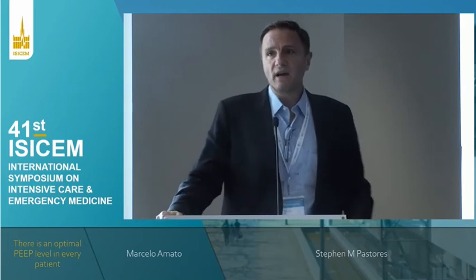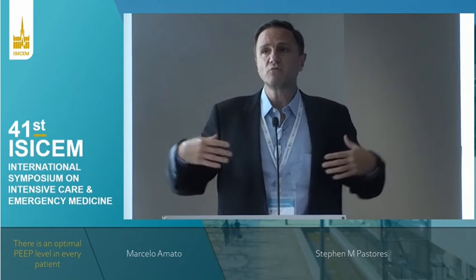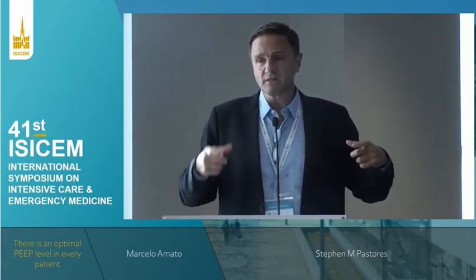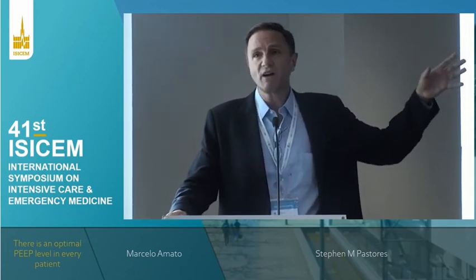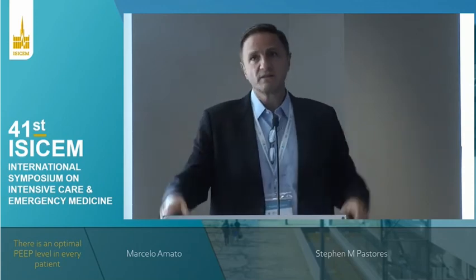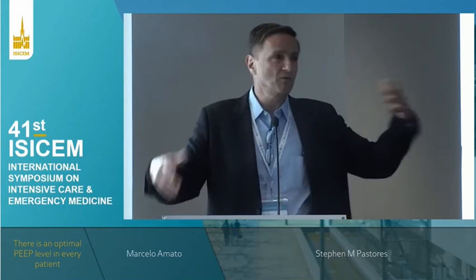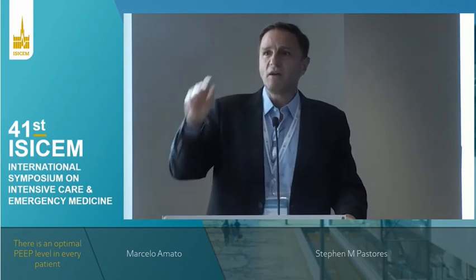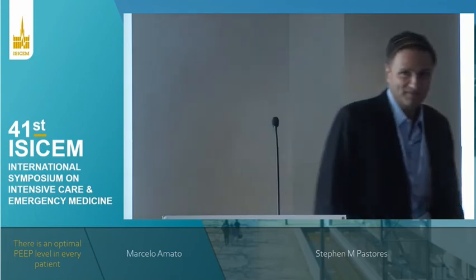And finally, there was a minimum PEEP level of 13 applied to patients like Oriental people in Brazil, because they are Indians. And these people typically, when I do titration, need just 5 or 8 of PEEP. So we learn a little bit, as we also learned from the old prone trials. So I hope we make, let's say, smaller mistakes in the future. Thank you very much.